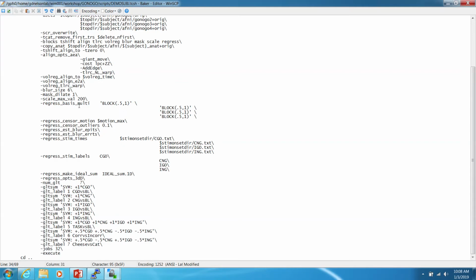But basically, it's a transformation: we've got this event that happens in time, it looks at everything after, and then transforms things so that we're looking at changes in response to that event as they progress further throughout the scan session. And that takes some time to evolve.